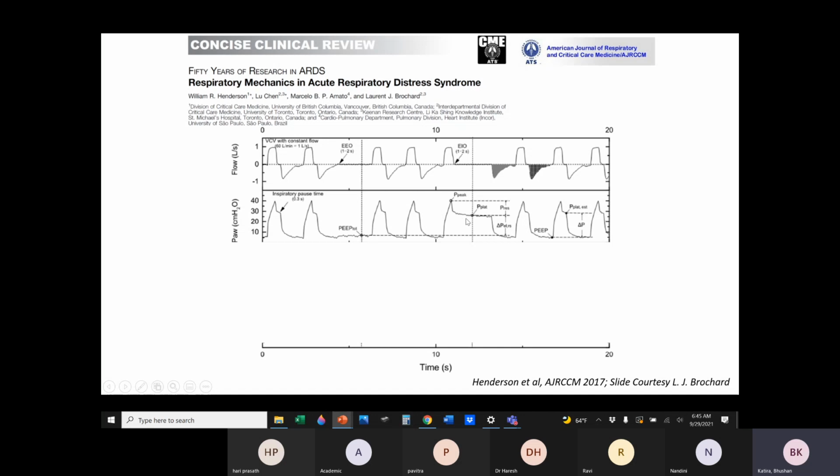As you do the pause a little longer, then this pressure starts to drop. This would mean that your resistive pressure is probably increased, you feel. But is that true? What does it mean?